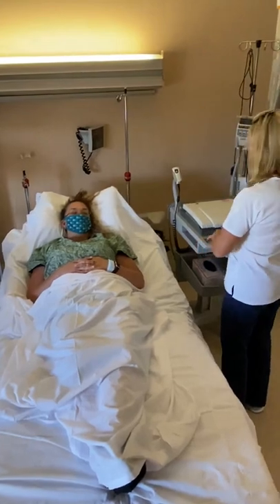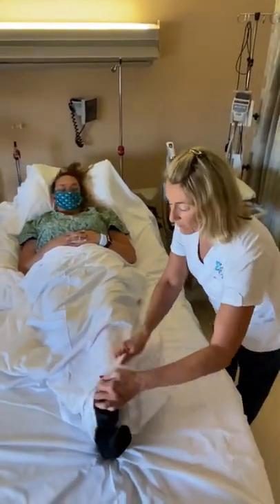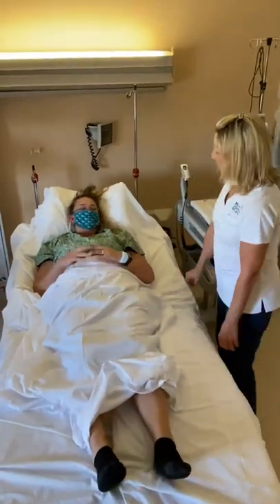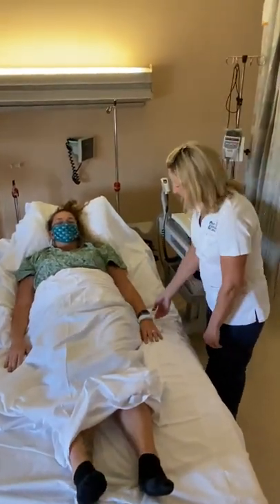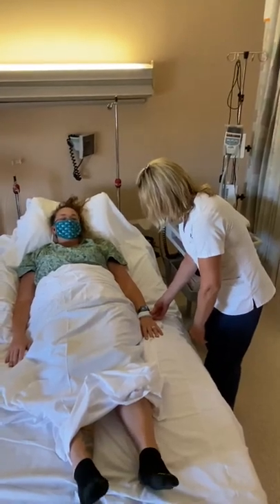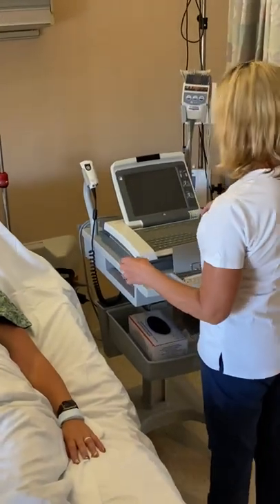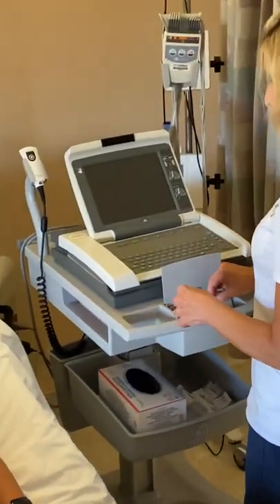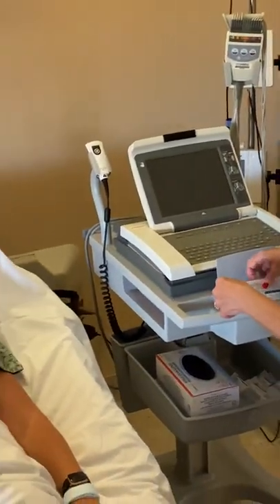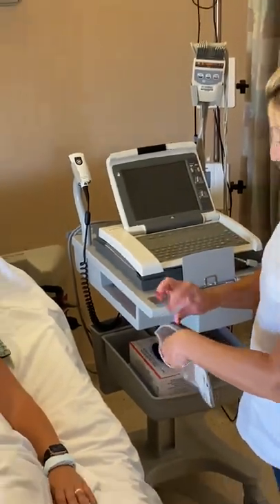Absolutely. Excellent. So your part in this is very minimal, but you do have to keep your legs uncrossed, and you have to keep your arms down by your side. I'm going to check your armband. What's your birth date? 7/20/80. Excellent. We have the right person. Are you allergic to adhesives at all? I get a little irritated by them, but they won't be on that long, right? We will take them off the moment that we're done. Perfect. Excellent.